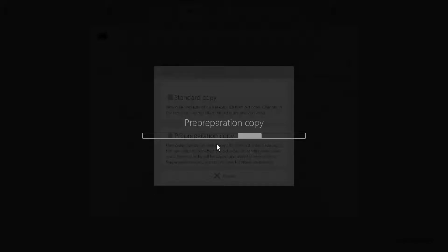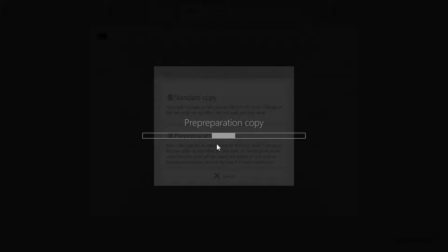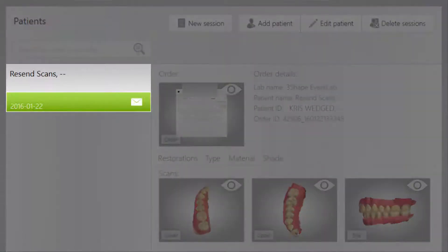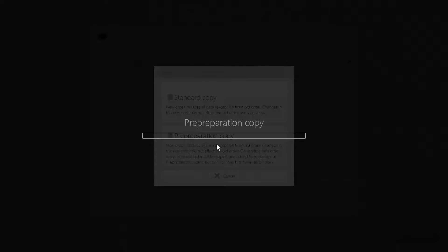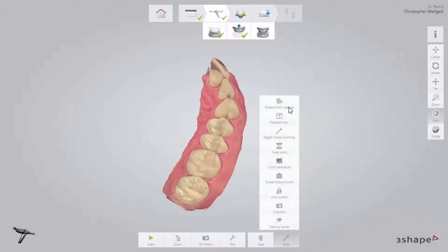It is important to note that the case you are copying must still have the original raw data. However, Trios will automatically delete this raw data after a certain period of time to keep your hard disk healthy. There are two ways to ensure you have the required raw data. The first way is to make sure that the preparation scan is made within approximately one month after the first scan. By doing so, the raw data will not have been removed yet. The second way is to mark the original case Protect from Cleanup under the Tools menu.